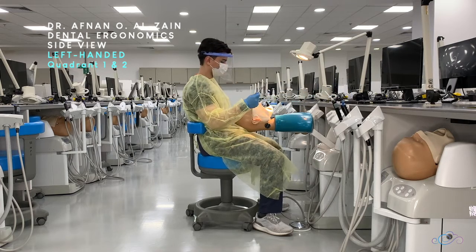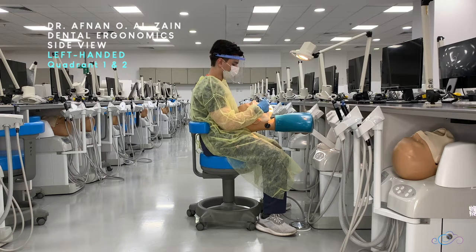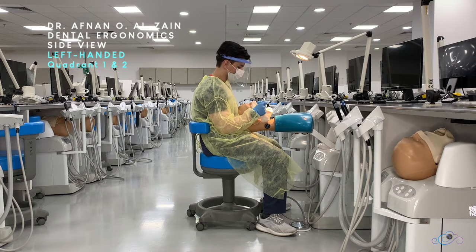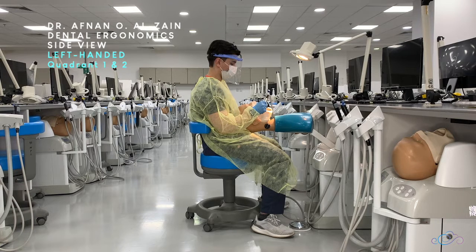You're going to hold the mirror and the handpiece, and you're going to sit mostly behind the patient. You can sit a little bit towards the left side if you're left-handed. When working on the palatal surfaces, you're going to use indirect vision.